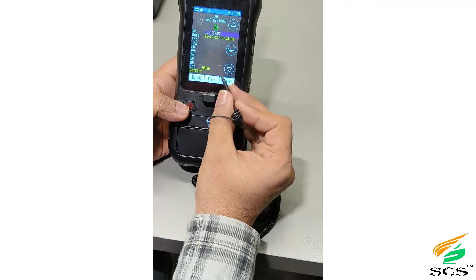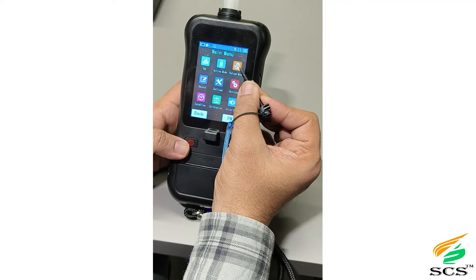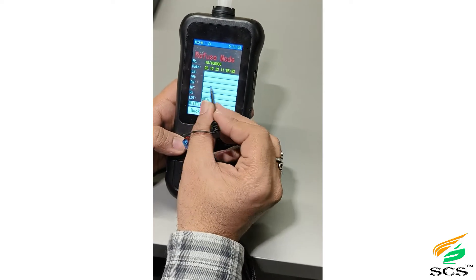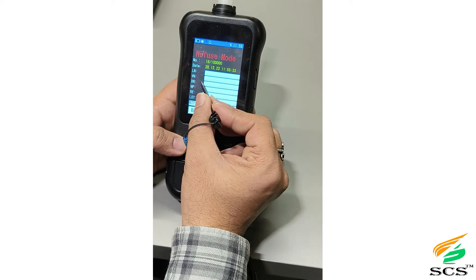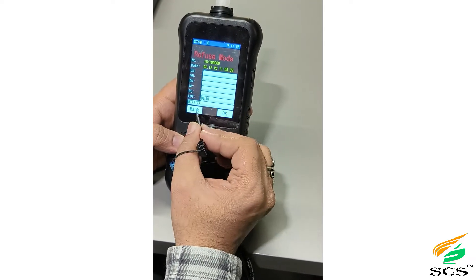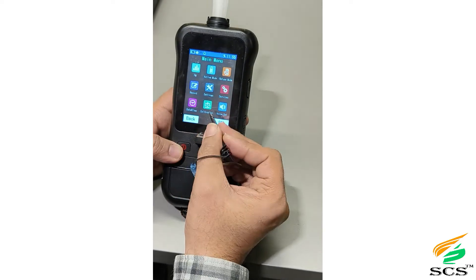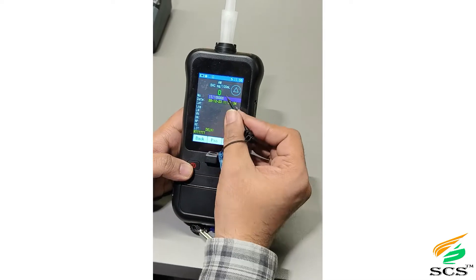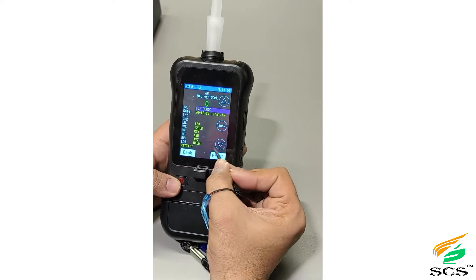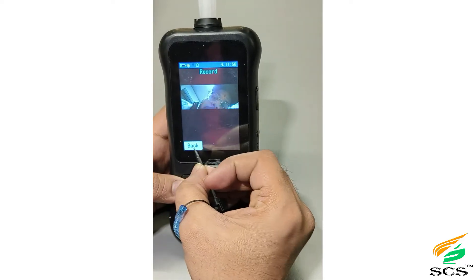Click Back to return. This is Refuse mode — if someone refuses to blow or has drunk too much, the officer can turn on Refuse mode and fill in all the details. All records, both old and new, remain in the Records section. From here you can also view pictures and take prints.